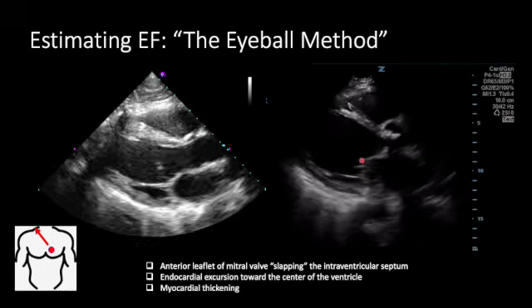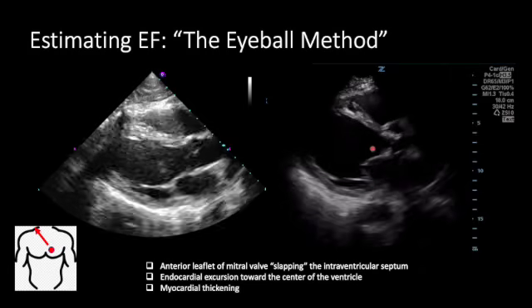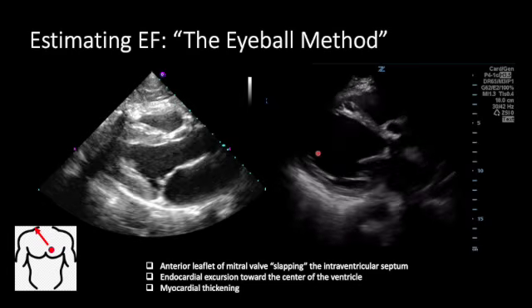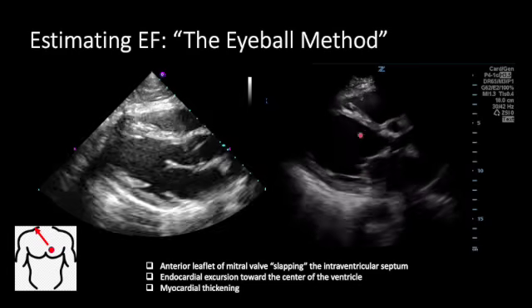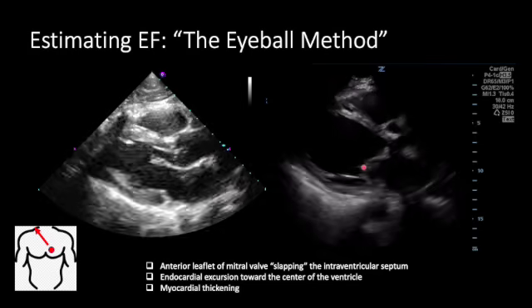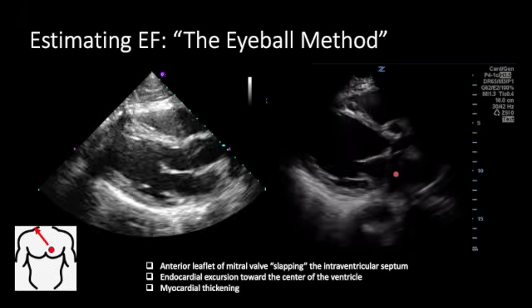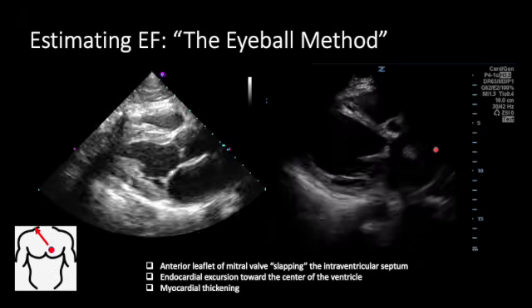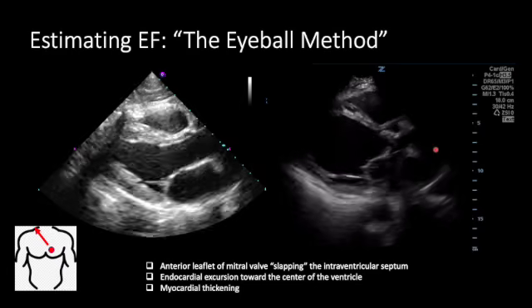And the reason for this is that because this left ventricle has a low ejection fraction, there's a lot of blood retained inside the ventricle that doesn't permit good motion of this mitral valve during diastole. And so it can't open really fully to allow a lot of new blood to come in because it's already filled with blood by not ejecting it from the previous cardiac cycle.